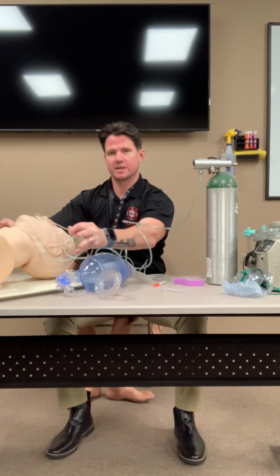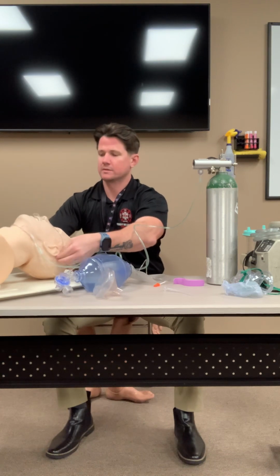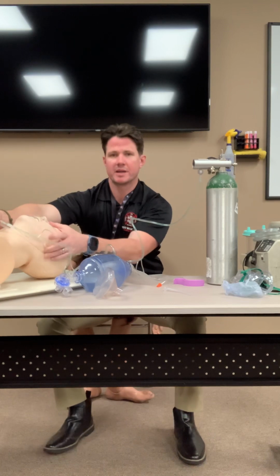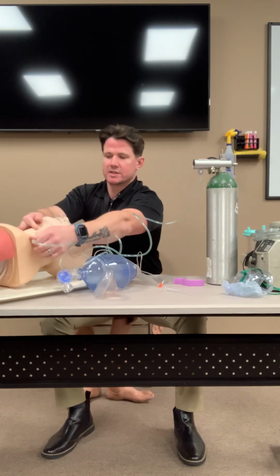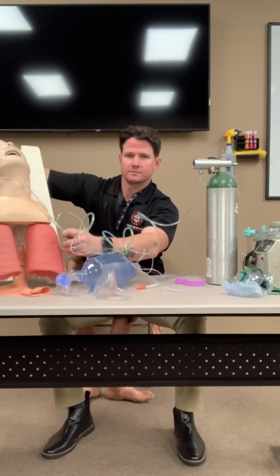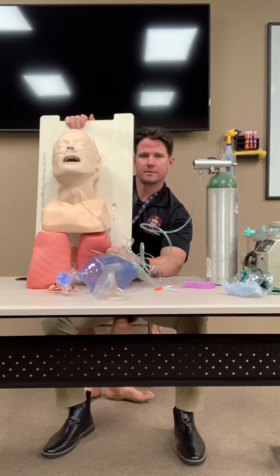Now come back towards you with the prongs into the patient's nose, all right? The 2 bunny ears that you have in each hand, wrap that around the ears, all right? Notice my little cinch is still under the patient's chin, all right? Now, I just cinch down the cinch lock, and it remains on the patient. Got it?